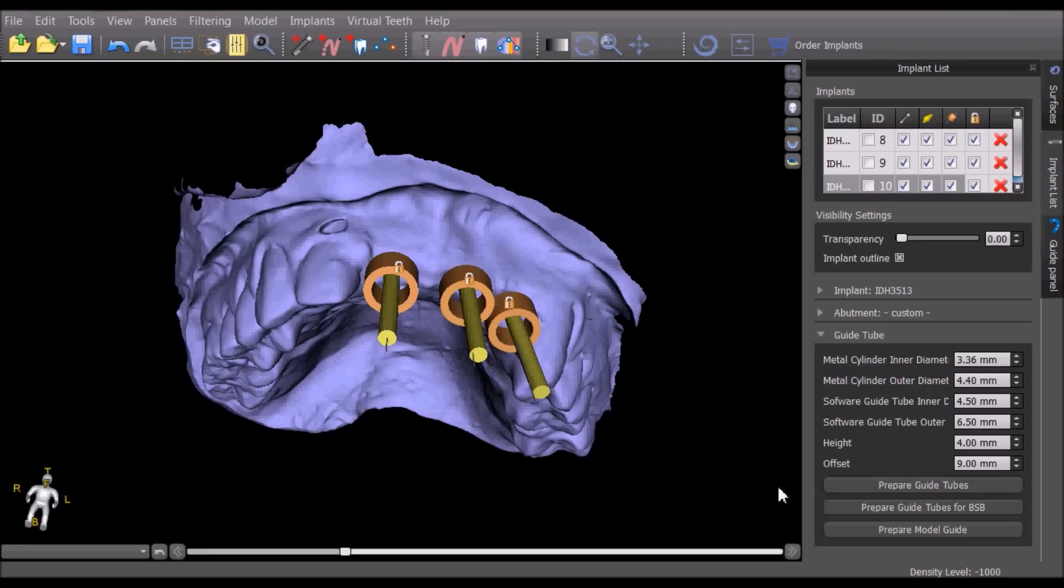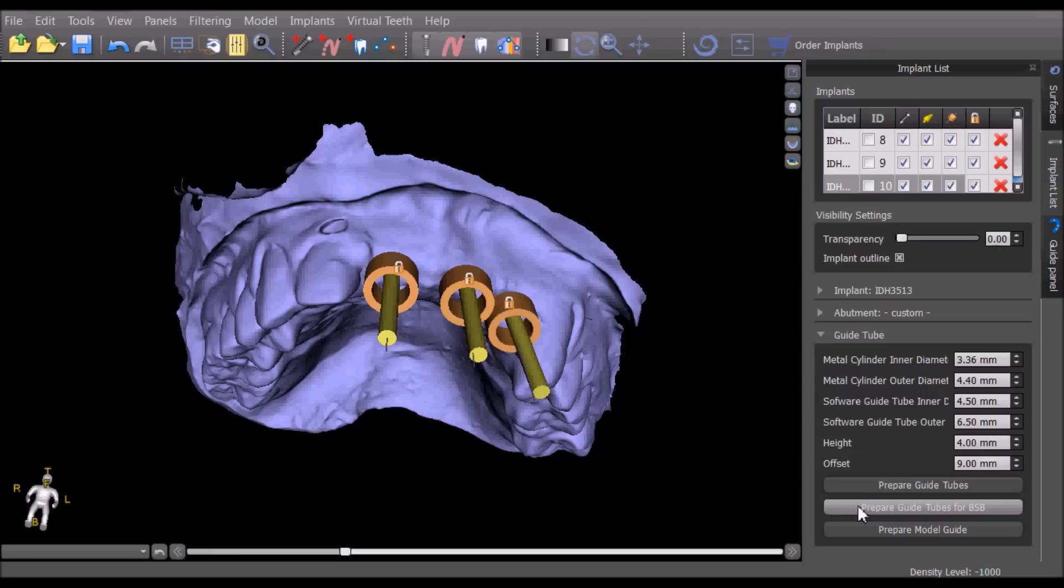If changes are made and you'd like to revert to the default settings to work with the direct cut solution, press the prepare guide tubes for BlueSkyBio button. If the direct cut solution is going to be used, no changes need to be made to the guide tube section.